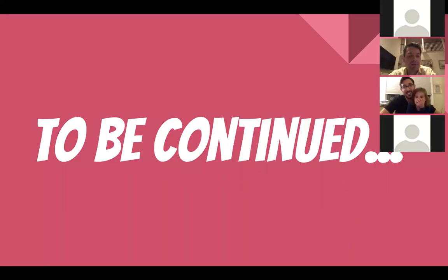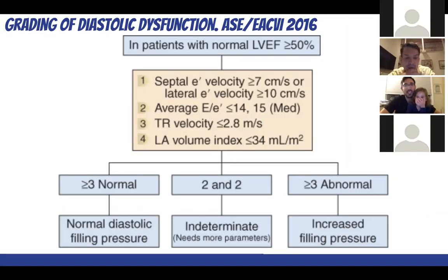All right. So previously we went over all these parameters, how to measure them, and what they mean. Now we'll go more into how we're going to use these parameters to diagnose diastolic dysfunction and to distinguish between different grades of dysfunction. Pretty much for the most part, as we talked last time, you need these four things to diagnose diastolic dysfunction.